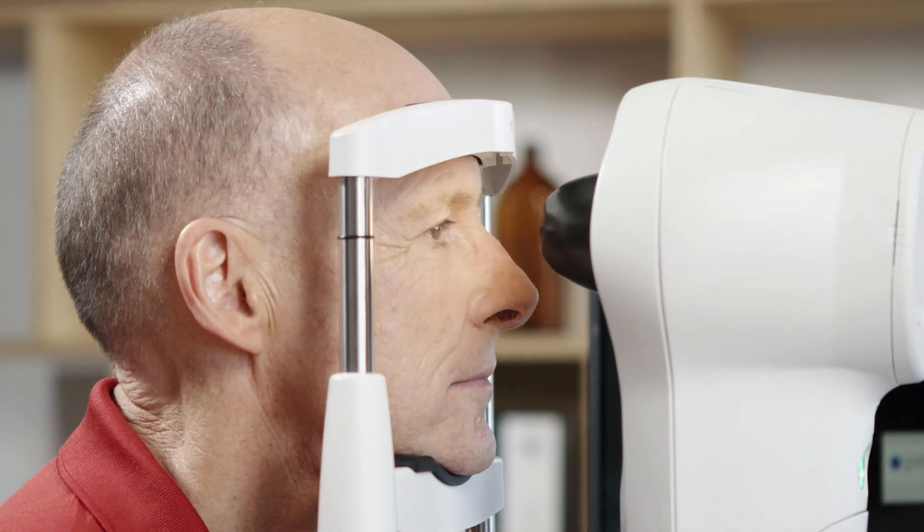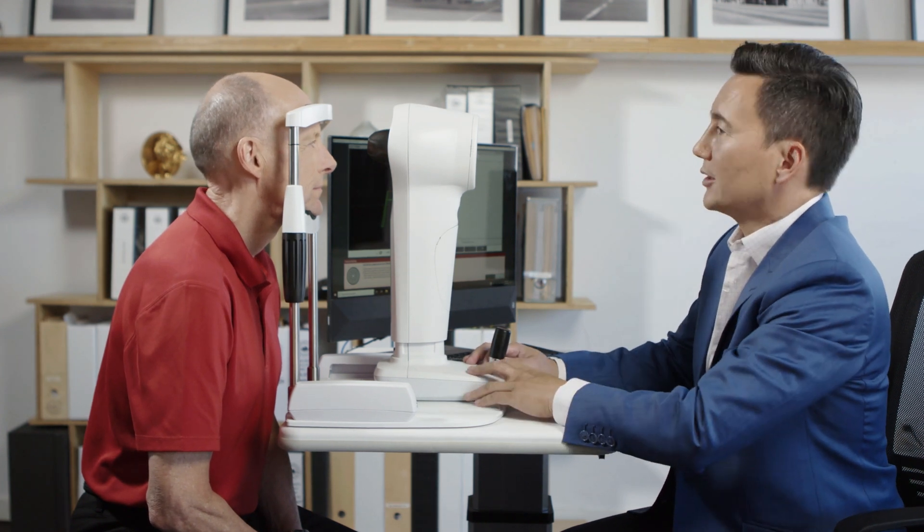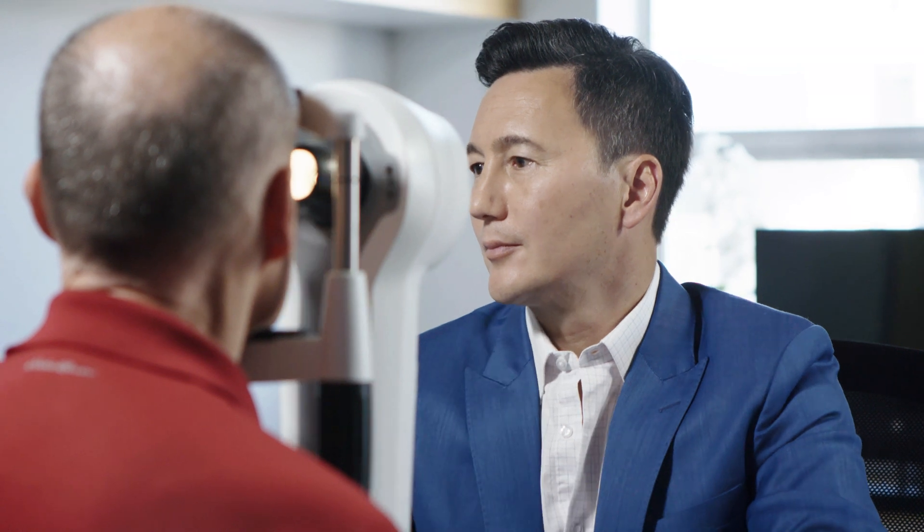If you are capturing the right eye, have the patient turn their head to the left. This will help to get the patient's nose out of the way of the cone.